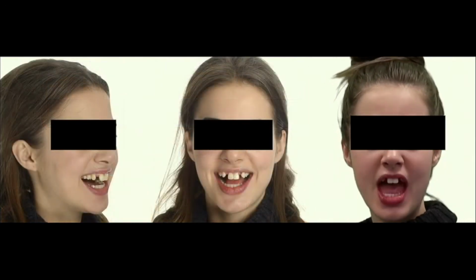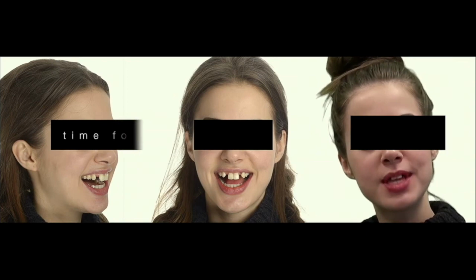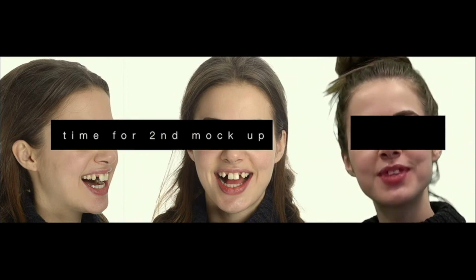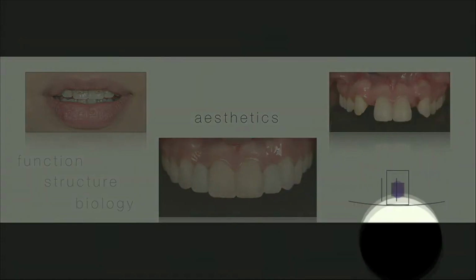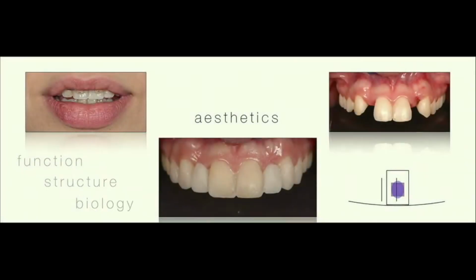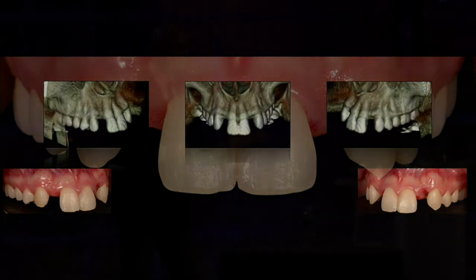Now we take the braces out, knowing that this case would work, and time for me to do my second mock-up. So now I have a free canvas to work on. I know the design. I'm just mimicking what we have done with the Visage smile and bringing it into my mock-up. So this is the case, and it's a very challenging case because we have less bone. The distance between the centrals and canines is very, very narrow.